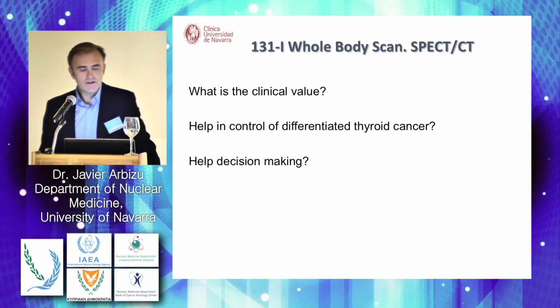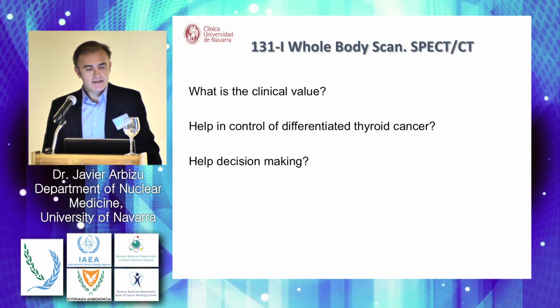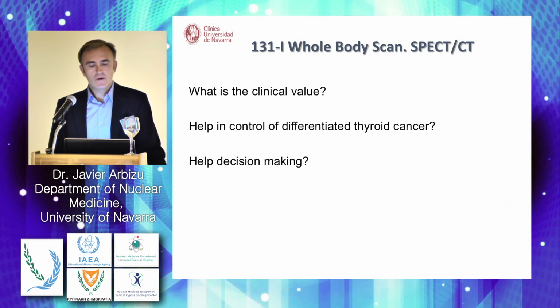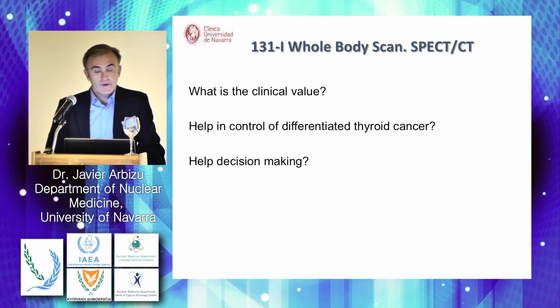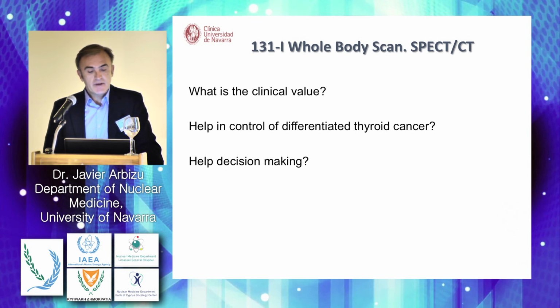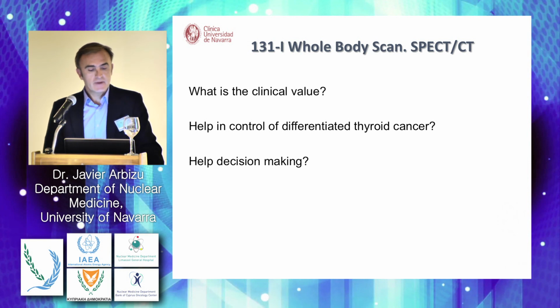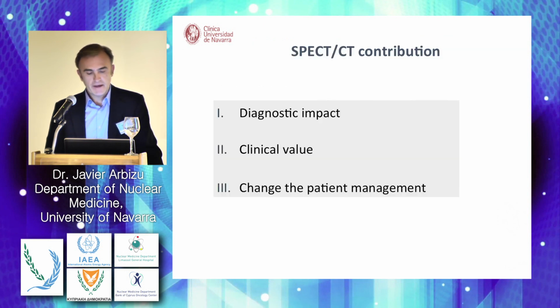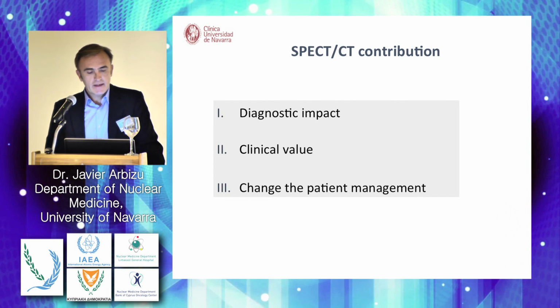So these are the questions I'm going to try to address in my lecture. What is the clinical value of SPECT-CT? We want to address how this technique helps in the control of differentiated thyroid cancer, and how it helps in decision making. Diagnostic impact.